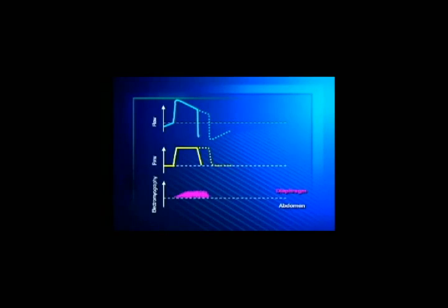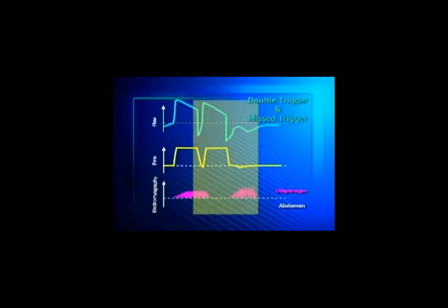Expiratory threshold, early cycling off. Setting a too high expiratory threshold can cause problems because you finish the ventilator assistance before the end of the patient neural inspiratory time. And usually this causes double trigger. It means that the inspiratory time prolongs till the time that the patient can trigger a new breath and he can get overinflated. This usually causes a lot of distress and dyssynchrony.